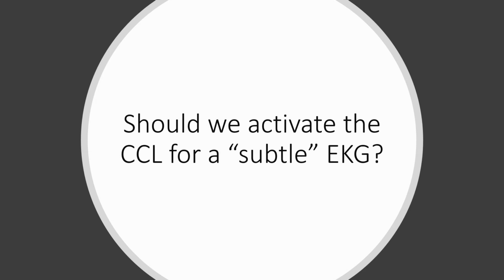The same goes with a computer interpretive statement that says that it's a STEMI. If the computer interpretive statement says that it's a STEMI, then the burden of proof is on us to show that it's not a STEMI. I would much rather get sent back to the ER because they disagreed with me than for the ER physician to look at the EKG and say, oh, this is an obvious inferior STEMI. I don't care too much about false cath lab activations.